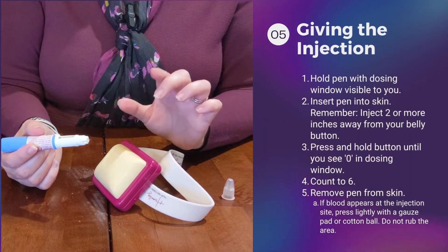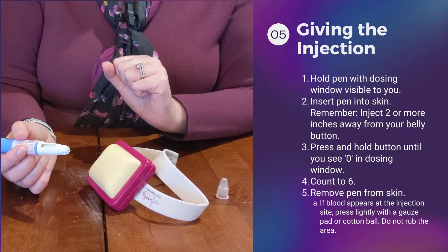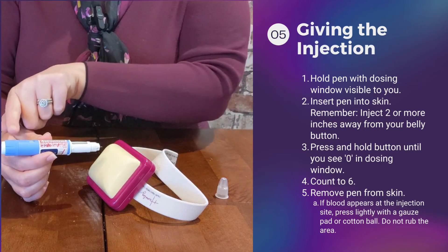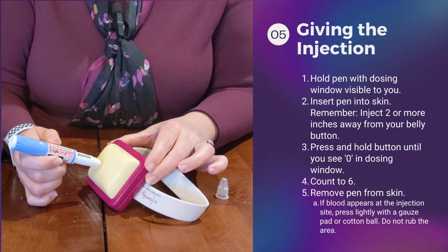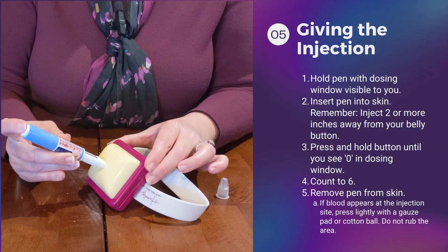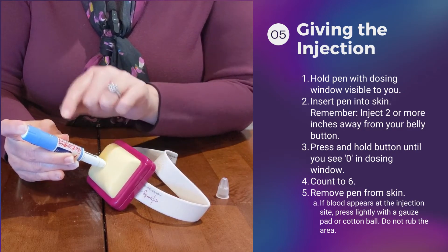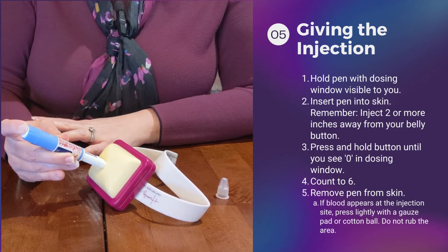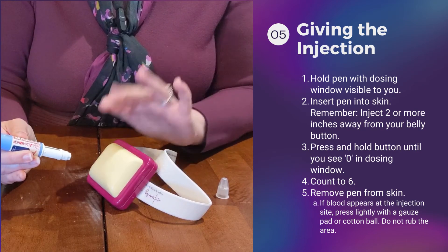You are going to give your injection in your abdominal area — remember, not within two inches of your belly button. Take your pen with the dosing window pointed up so you're able to see it, and simply insert the needle into your skin. There's no need to pinch. You're going to press this white button and hold it until the dosing window shows zero. Once it shows zero, count to six. At the end of six, remove the pen from your belly.